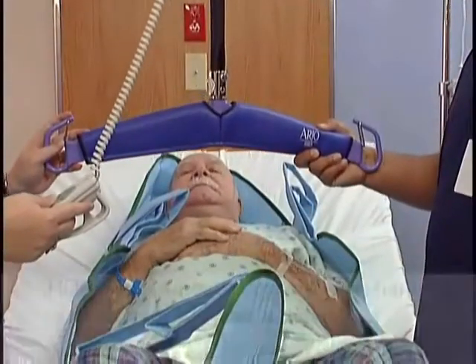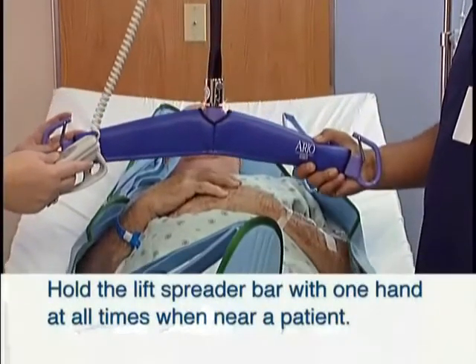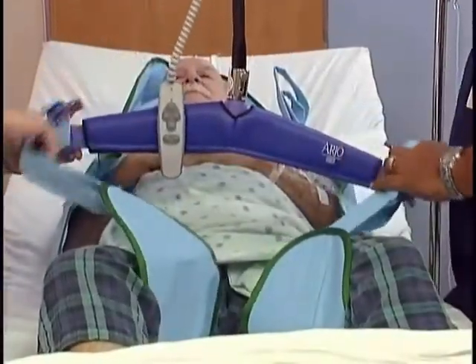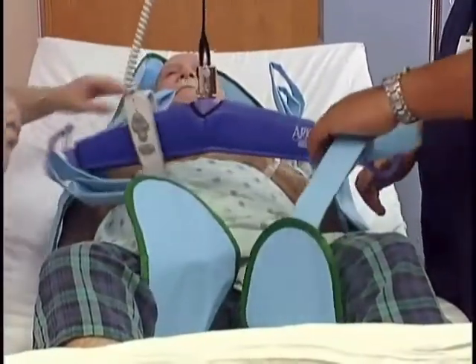As you lower the hanger bar, hold the lift spreader bar with one hand at all times when near a patient. Attach the straps or clips to the hanger bar in the desired position.